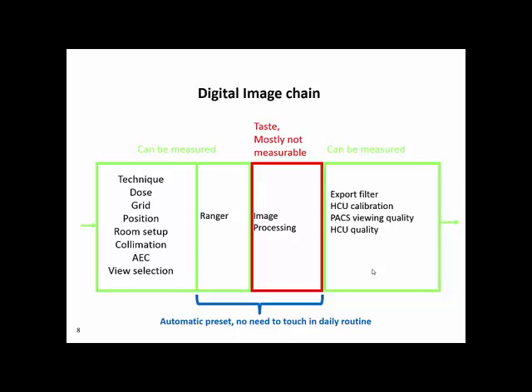Coming to DR, still we have the same thing about the technique setting, and here we clearly see whatever media we are exposing on, basic X-ray physics did not change and does not change. Still, the operator needs to know what KV should be used, what dose, what about the grid, and so on. So it's very important to know that basic X-ray technique has no change between film and DR, except the dose, which can be lower of course, but still this is an important part.